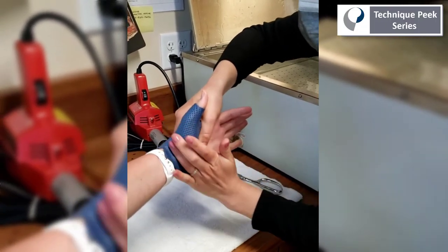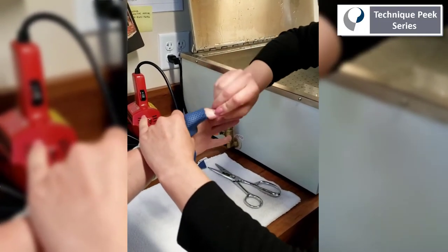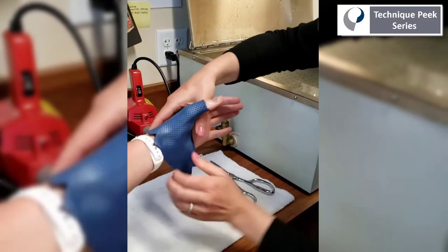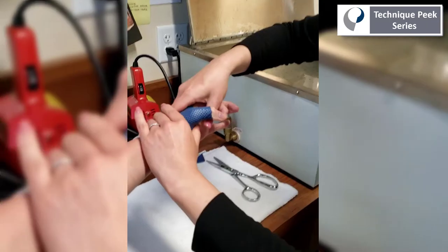Then we'll conform the material just below the distal palm crease, make room for the thumb, and have the patient oppose the thumb to the second finger to get good palmar abduction.